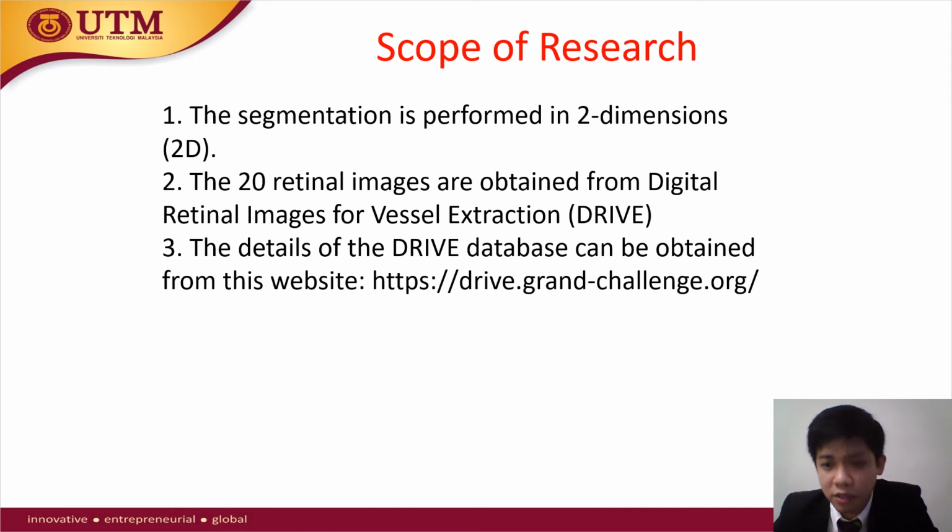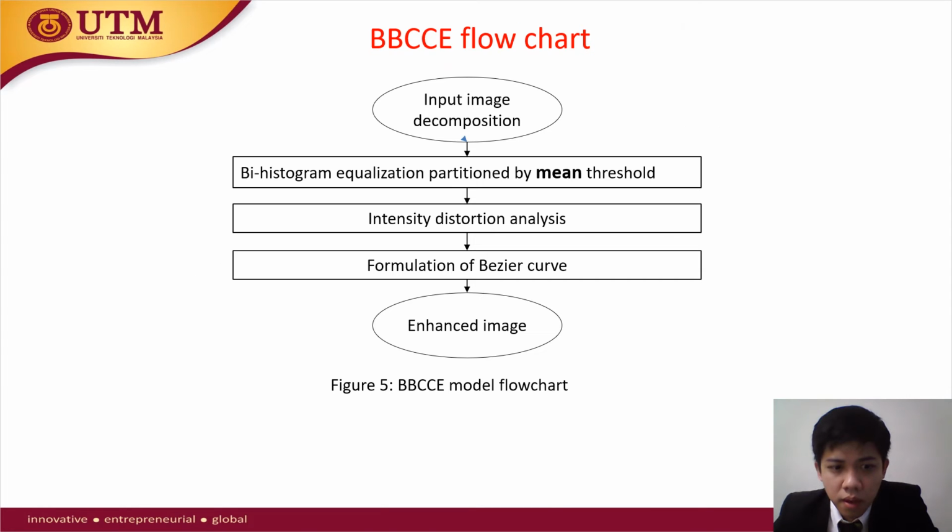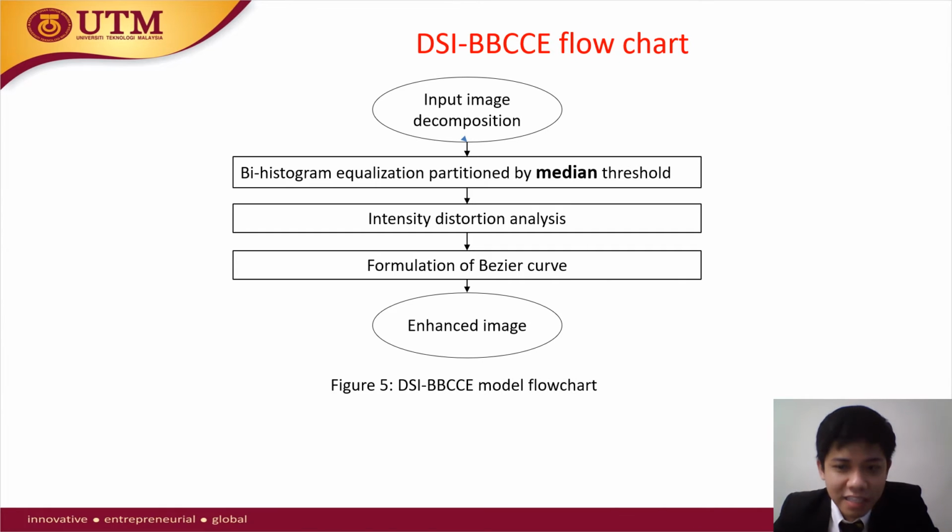There are 20 retinal images obtained from the Digital Retinal Images for Vessel Extraction, DRIVE. This is the BBCCE flow chart, which is based on the mean threshold, while DSI-BBCCE is based on the median threshold.